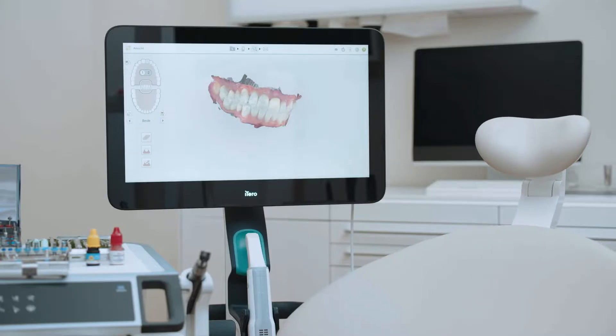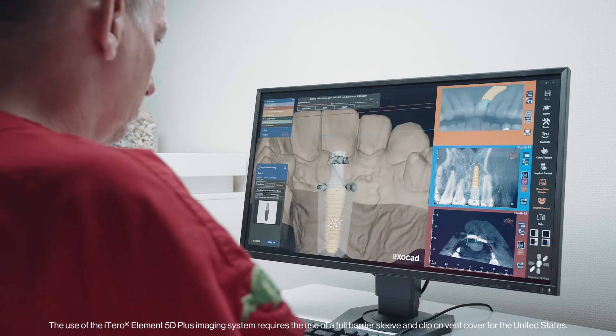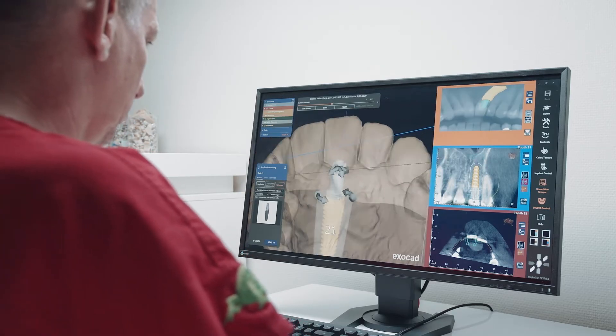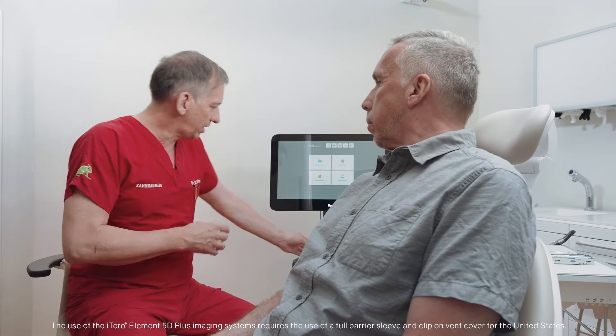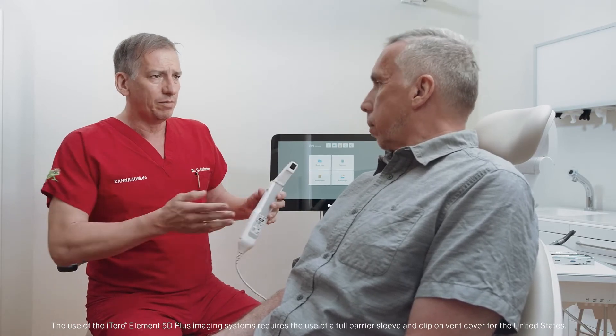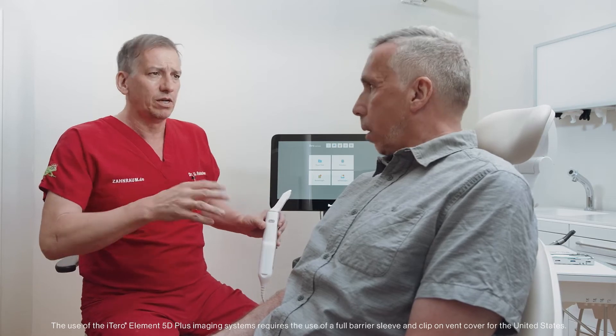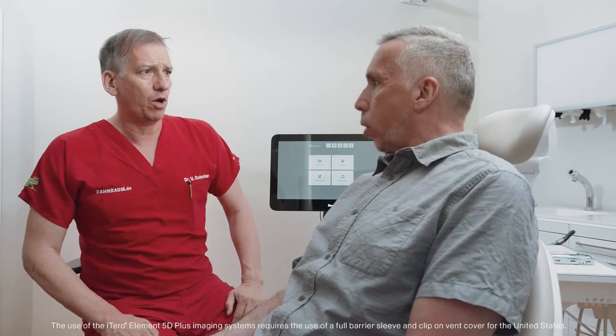With roots in restorative, iTero scanners are versatile and designed to streamline and enhance a range of digital workflows, like a chairside implant and crown. Dr. Radmacher will demonstrate just how intuitive the digital workflow for a chairside implant and crown can be, thanks to the iTero scanner's open system, which allows for the easy transfer of files to chairside dental design software.